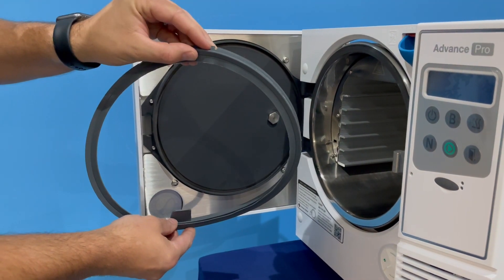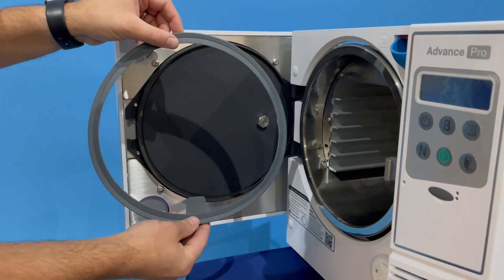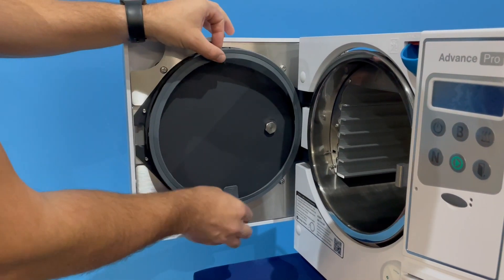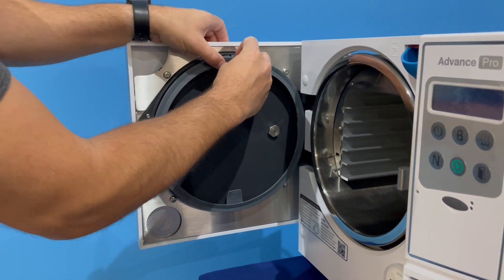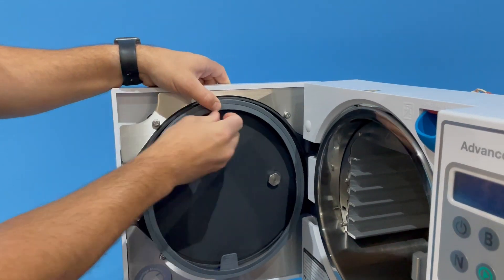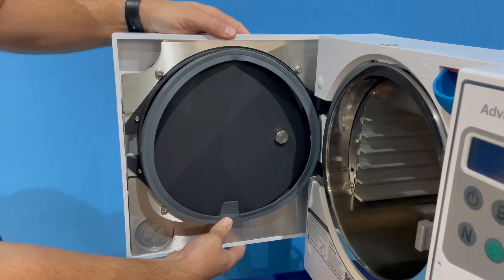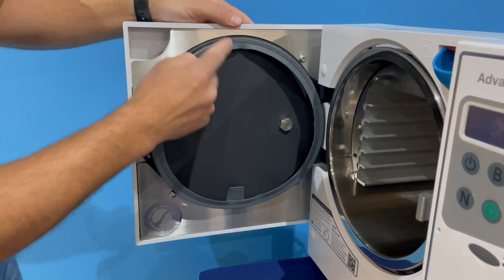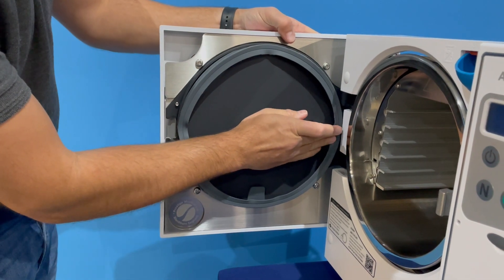First of all, ensure that the slot is placed at 12 o'clock at the top of the door itself. So what you're going to do first is slowly place the top of the gasket on the top, like so, and then the bottom, and then you're going to work your way around the two side pieces.